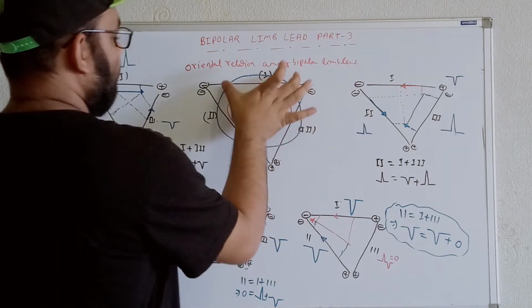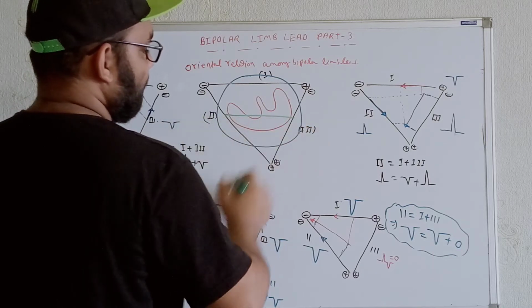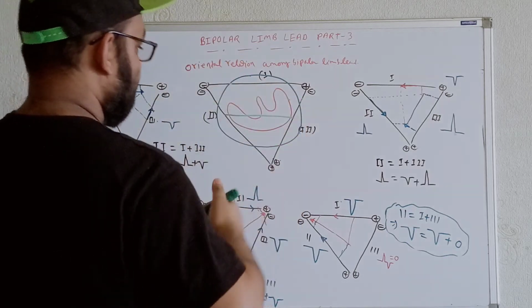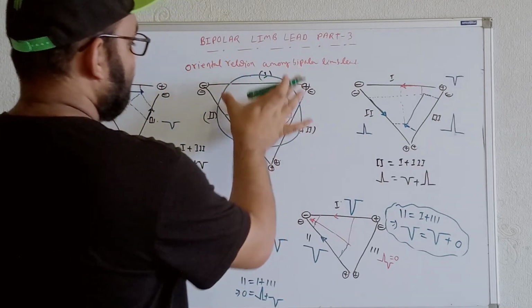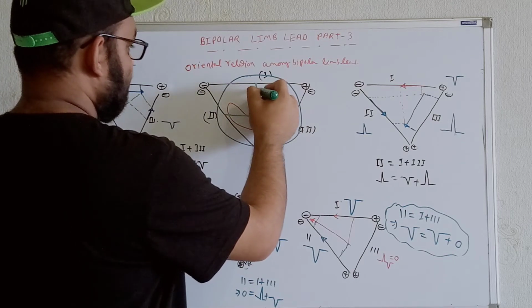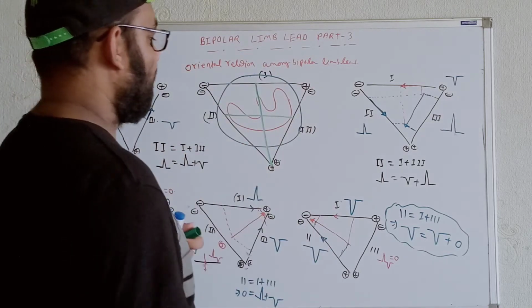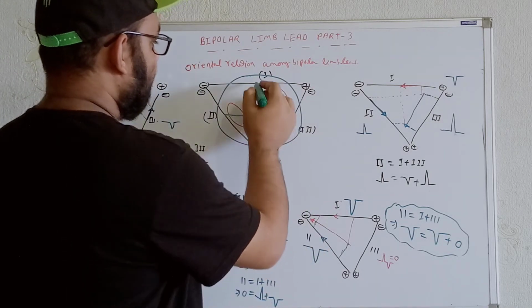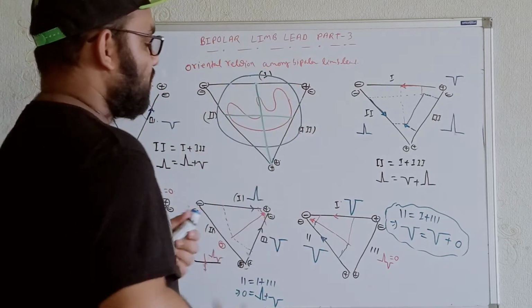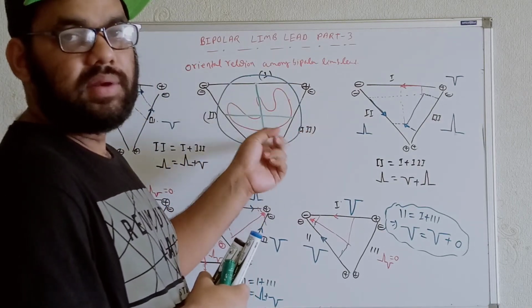If I draw lead number 1 over here, and if I draw lead number 2, that means this one over here, I have just drawn lead number 1, and I am dividing this whole circle into 4 divisions. The whole circle is 360 degrees, so each division will be 90 degrees.